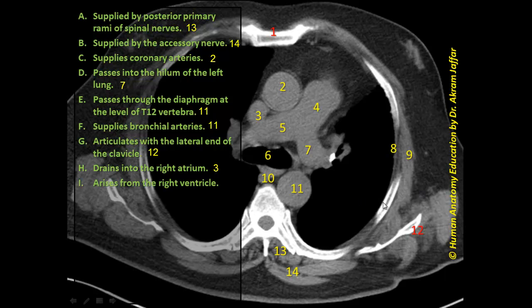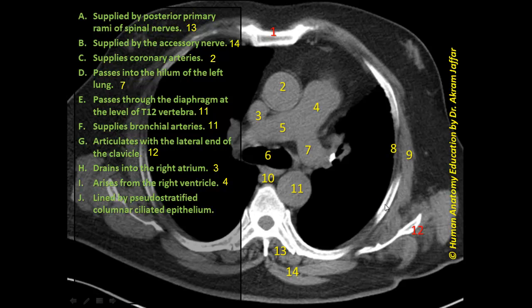The phrase 'arises from the right ventricle' — the artery that arises from the right ventricle, specifically from the infundibulum of the right ventricle, is the pulmonary trunk. So this matches with structure 4.